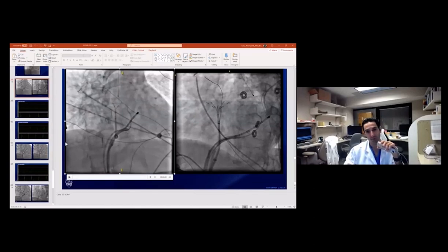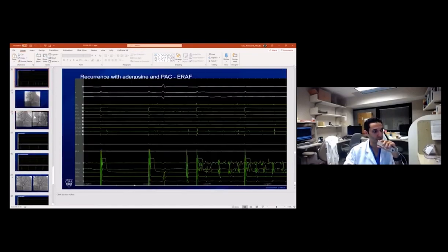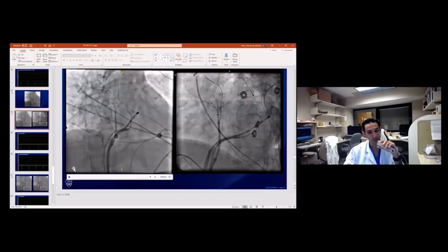Now, we were able to isolate the vein just with catheter ablation on the left, both on the vein side of the left lateral ridge, the Coumadin ridge, as well as from the appendage side. But given that this was her 3rd ablation procedure, we wanted to be as thorough as possible. And with adenosine testing, we continued to have dormant conduction into the vein. And we noticed what we thought was a very thick left lateral ridge, as well as potentially a vessel through it.